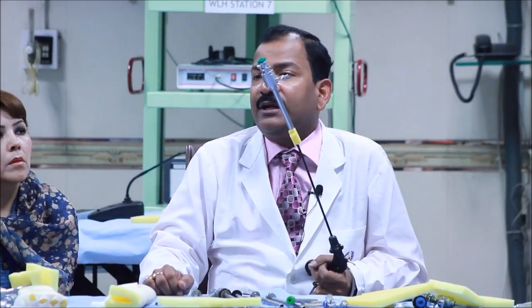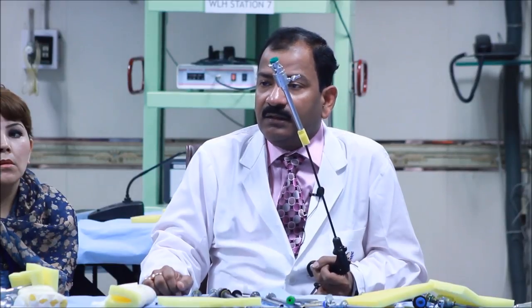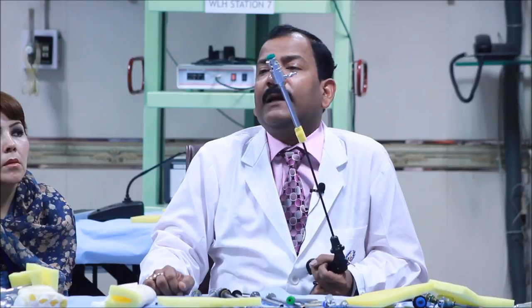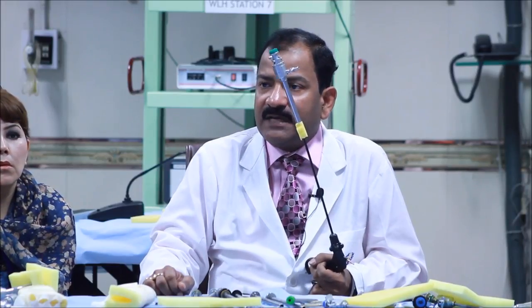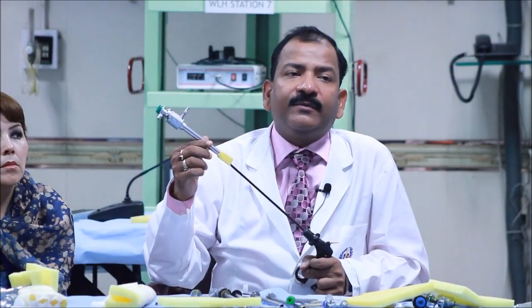And seeing from where? Seeing through the camera. Gradually withdrew with the camera, at the same time retrieving the gallbladder through the port, and going out slowly until coming out. So, your epigastric port is 5 mm? Yes, all 5 except the epigastric. If you are using a 5 mm epigastric port, then you can use it.